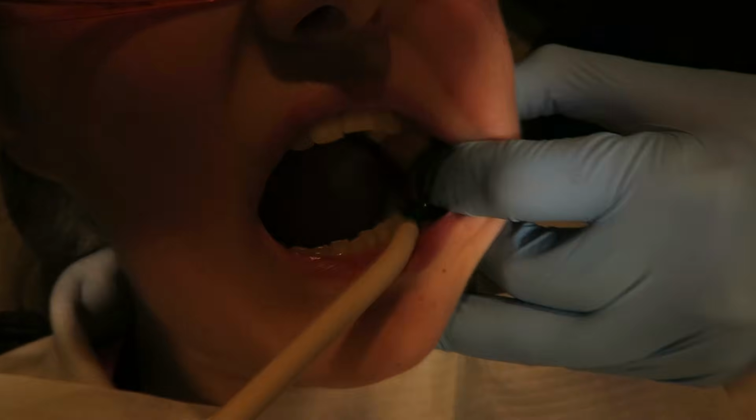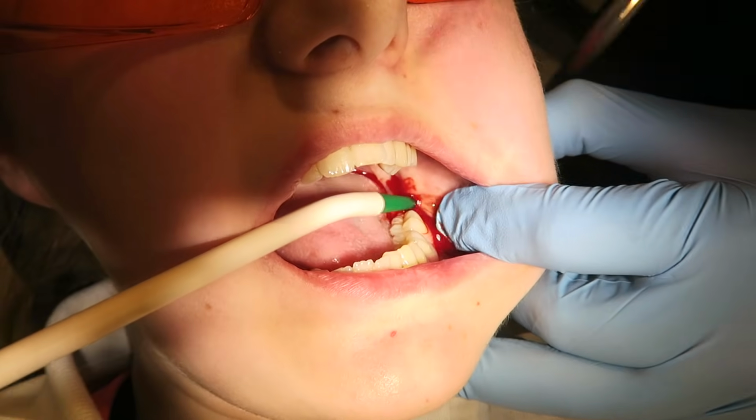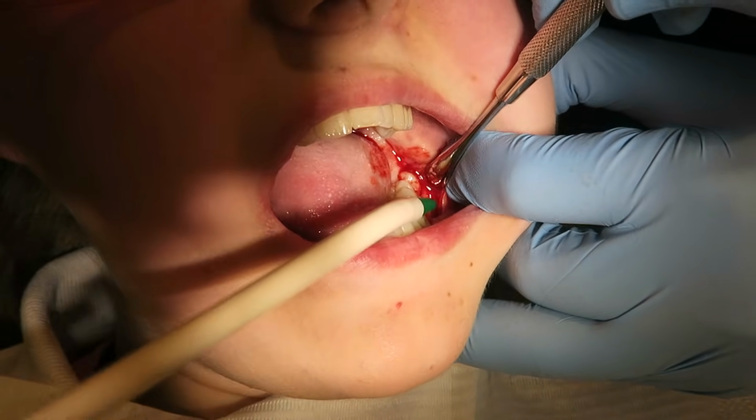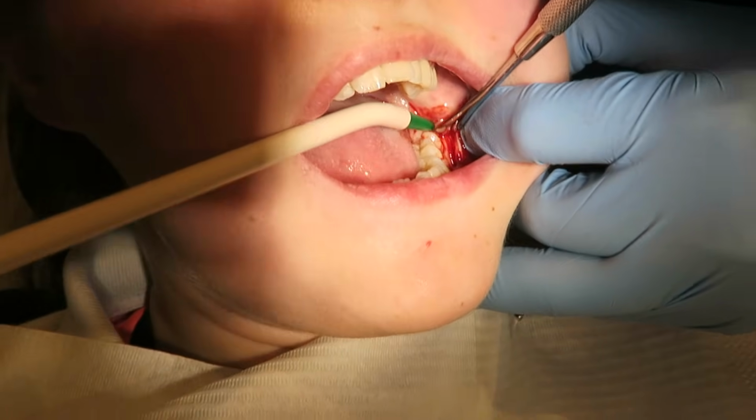It's always nicer, and also it makes life easy to stretch the tissue as much as you can. Once you've cut your incision, you retract the flap using the periosteal elevator.